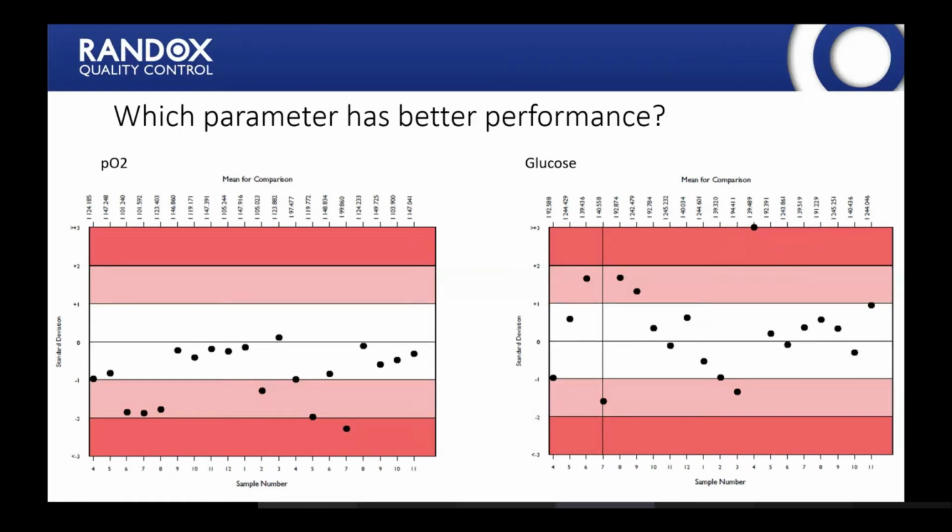So we just want to demonstrate how, again, you might see different things when you look at the different reports. So this is from a blood gas report. So we have PO2 and we have glucose. And if you look at these reports, we're just going to talk through each of these and see which one we think has maybe better performance. So for the PO2, we can see there are a couple of results that are sitting outside the acceptable limit, and it appears that the lab is running with a negative bias. So there's only one result here that's actually above the mean for comparison.